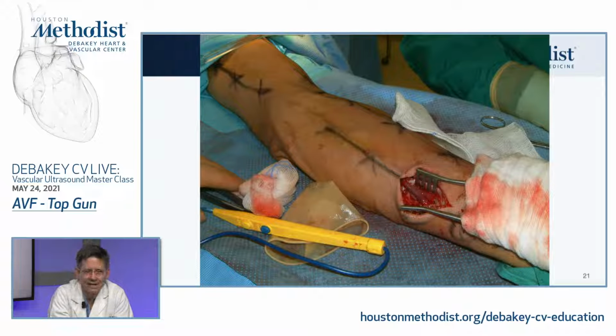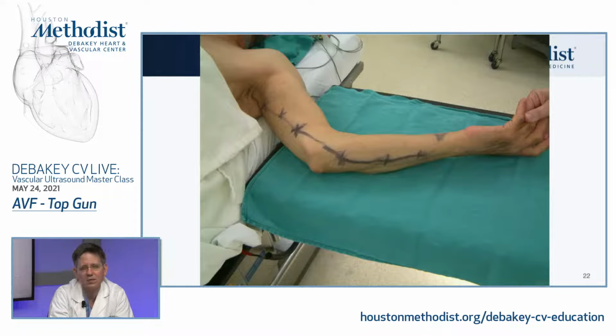This is not a vein that I was expecting to find, and a radiocephalic fistula is not an option, but this is an ulnar artery to sort of a tributary of the basilic vein that ran right over the forearm. I was expecting them to see this one on the back of the arm.